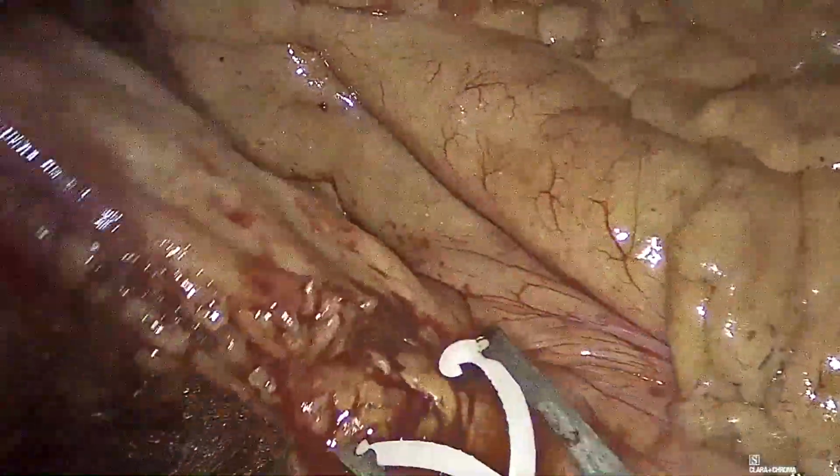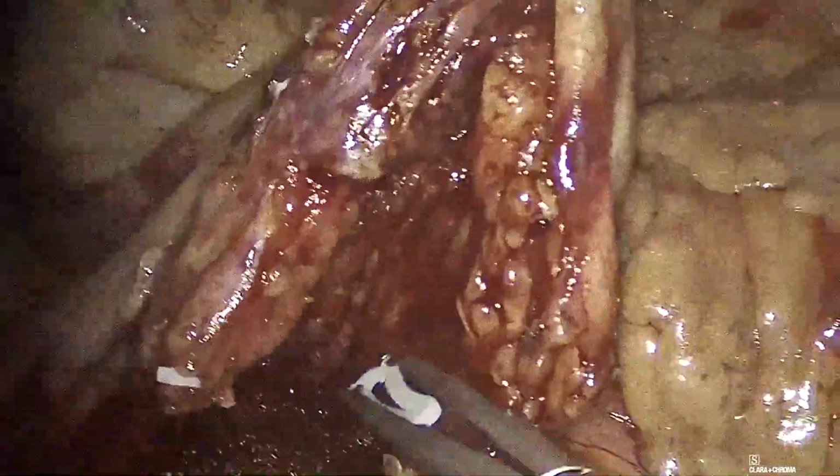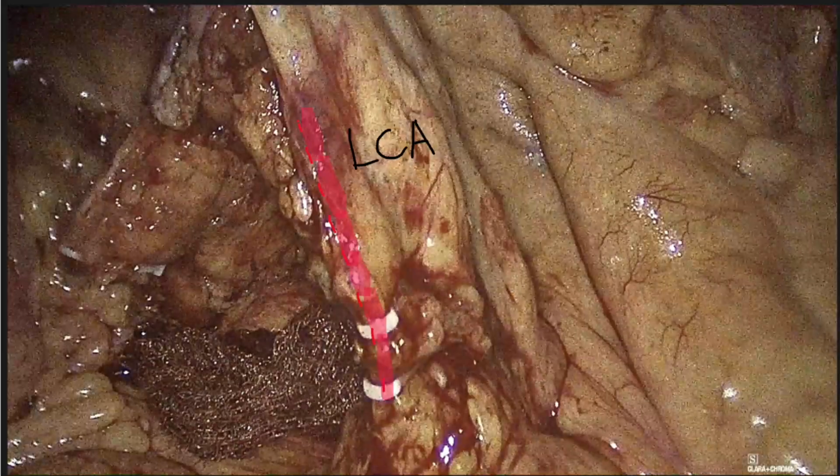After adequate mobilization, the left colic artery was identified, clipped, and cut.